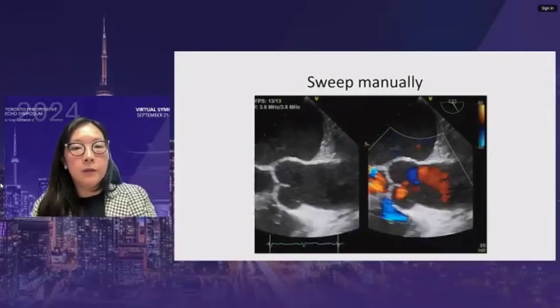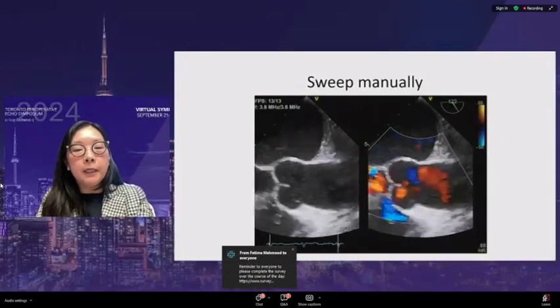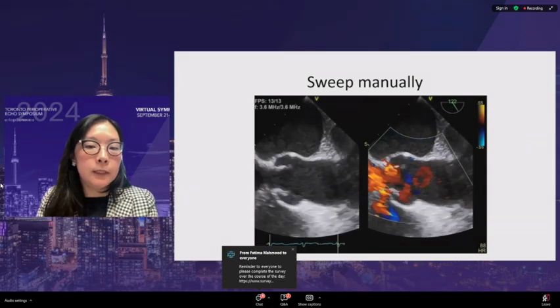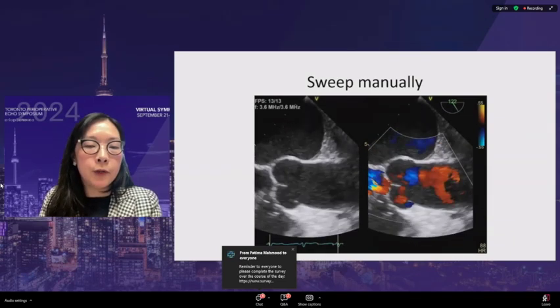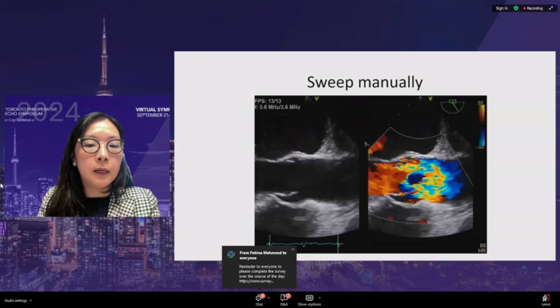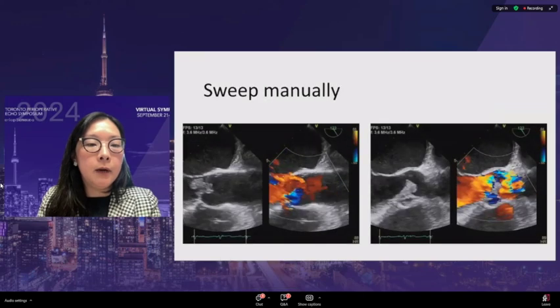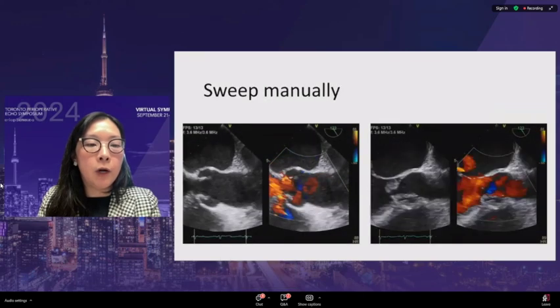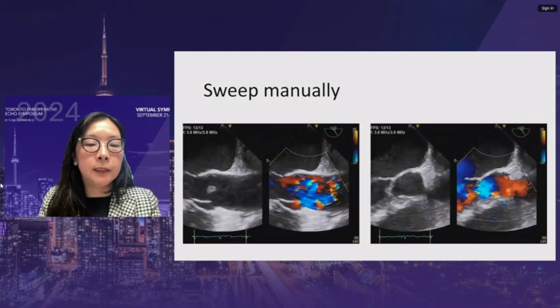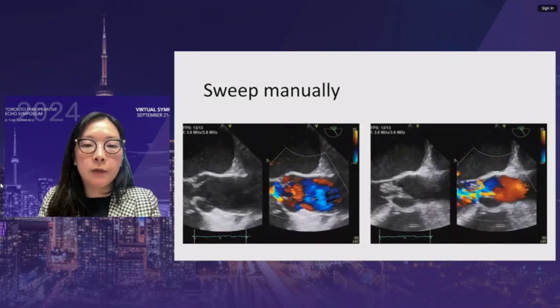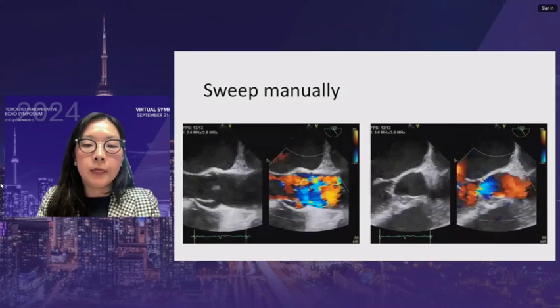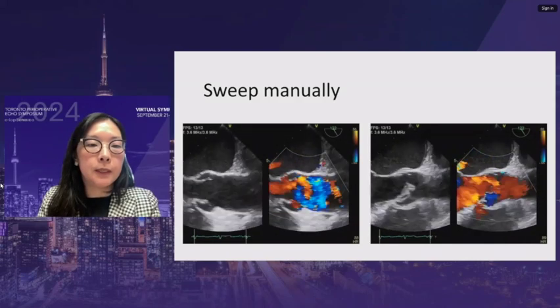Manual sweeping of the probe is important. Starting from a normal view showing a little aortic regurgitation, clocking the probe reveals a mass on the aortic valve with significant regurgitation. Clocking even further reveals actual abscess formation adjacent to it.